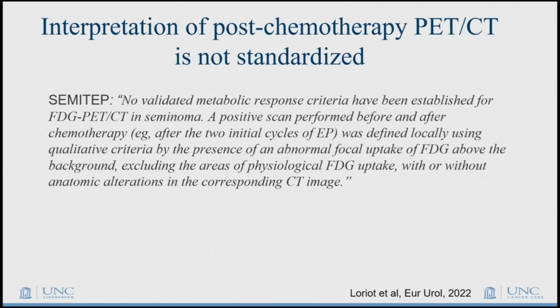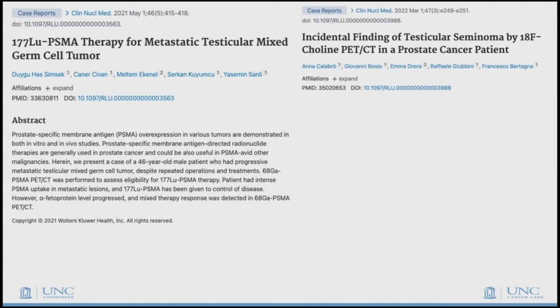I'll say there's also really not, as it is hard for our radiologists to tell us if a PET is positive or negative, and they are commonly wishy-washy after chemotherapy. Same here, a validated metabolic response criteria has really not been developed for seminoma, and so this is really investigational at this time.